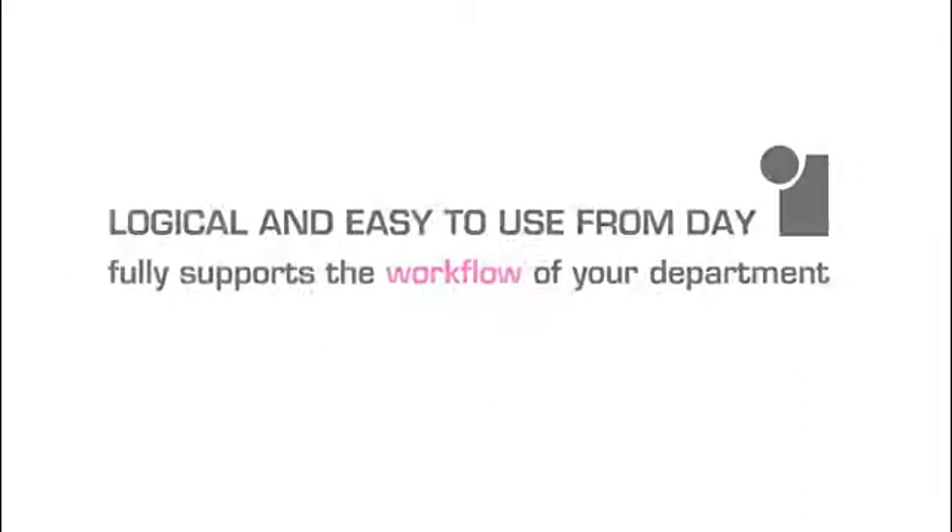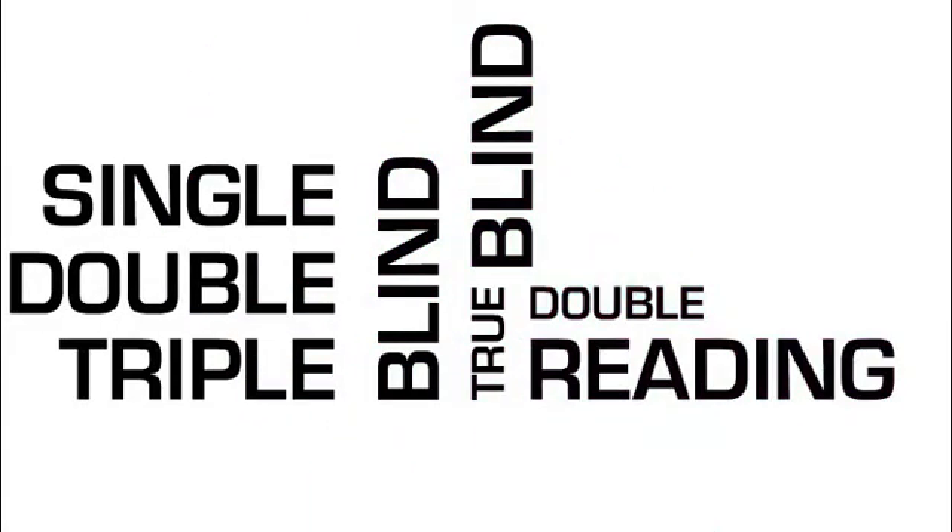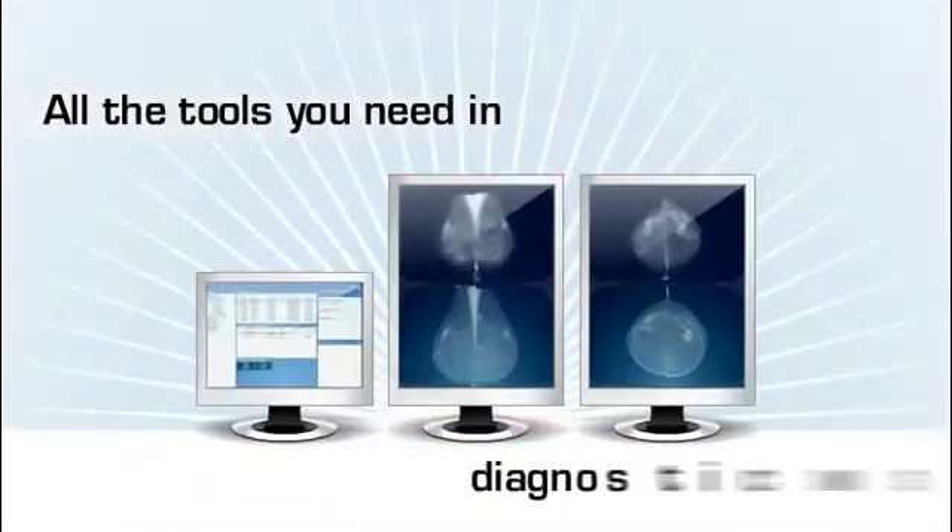Logical and easy to use from day one, this solution fully supports the workflow of your department, including single, double or triple reading, regardless of whether you need blind or true blind double reading. As you'll discover, you have all the tools you need in one diagnostic workstation.